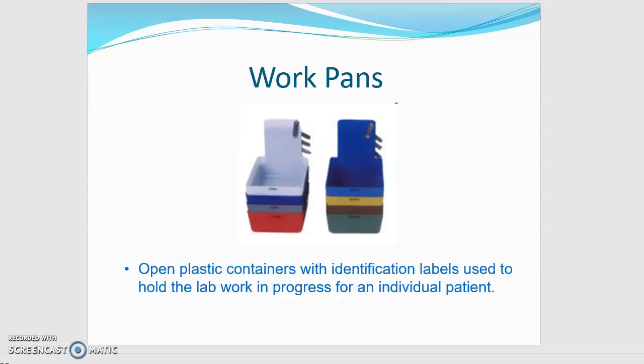So different types of dental lab equipment. We have our work pans, which you guys have seen. We've used these to store our models. In the office, these might be used to store preliminary impressions or lab cases that are out being made, the crown's being made, and there's a 2-week period where maybe other impressions or models are sitting in that pan waiting until the final product is returned to office.